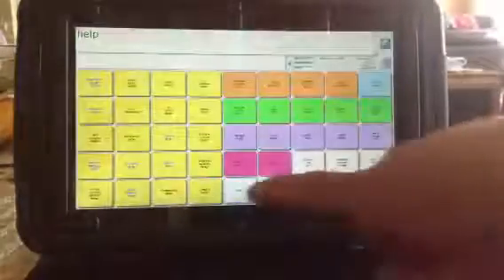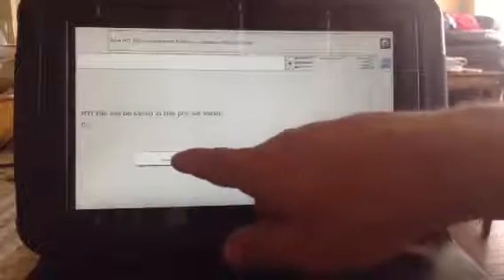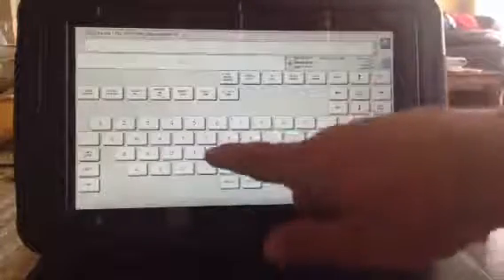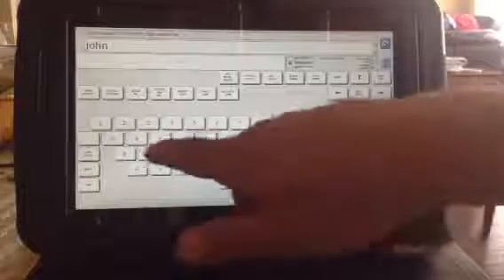Hit that button which takes you to the tools. Then go to the one that says Transfer Memory Menu. Now you have a couple of choices here — this is how you can do all sorts of things. But what we're concerned with is saving the device. If you select Save Entire Device, then say yes and go to that D drive. Now I can name this — I'll name it John.